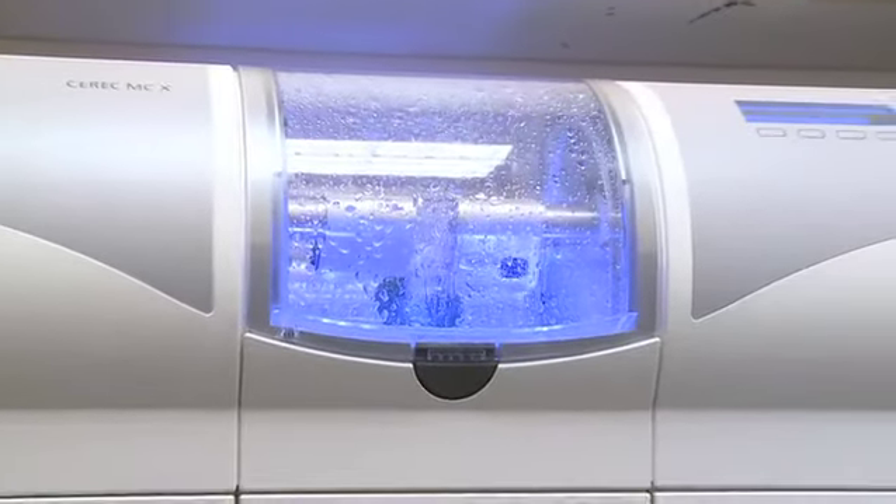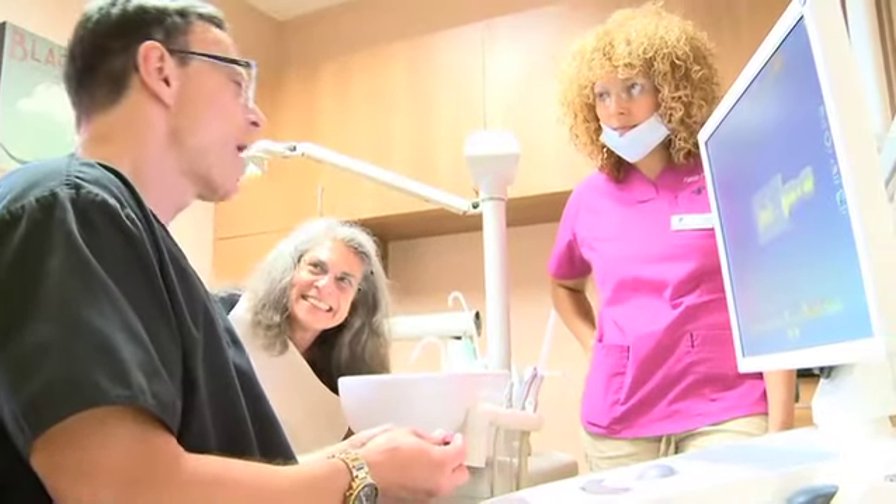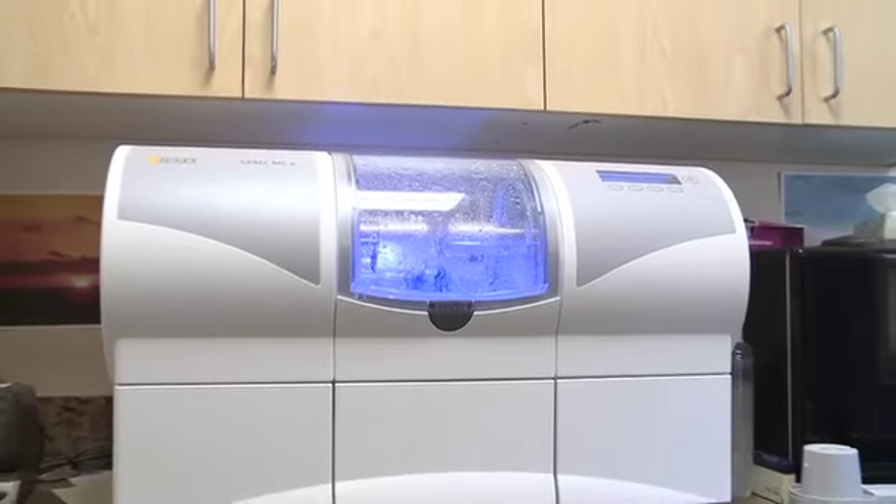After the crown is designed, we mill it right here in the office. This is a totally ceramic crown so it looks just like a tooth — no metal involved, nothing to turn black, none of that nonsense like the old crowns. It looks like a tooth; it's beautiful. We fit it on the patient's tooth, then fire it so it gets nice and hard — a hammer won't break that thing — and we bond it onto the tooth. How many times do we have to remake these? Never. They always fit because I'm preparing the tooth and designing it all the same day, not trying to translate what I'm doing to a subcontractor.